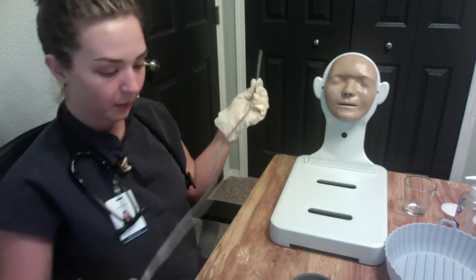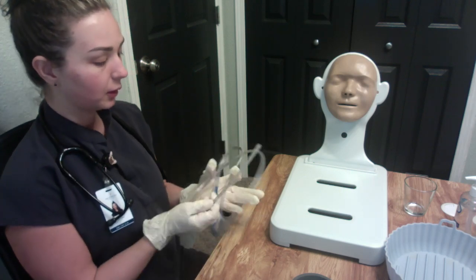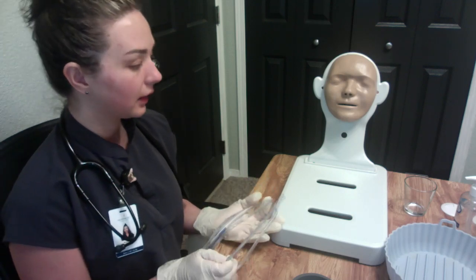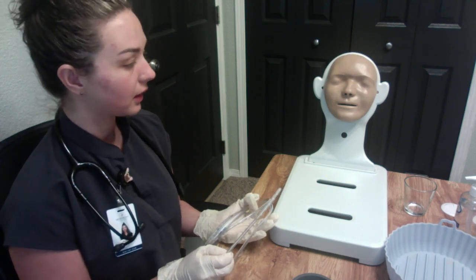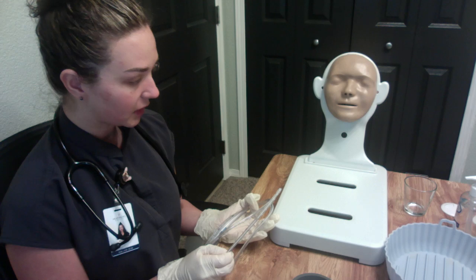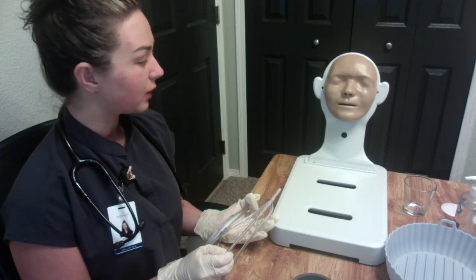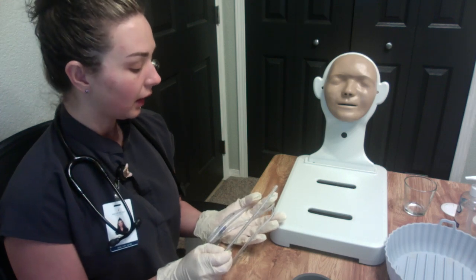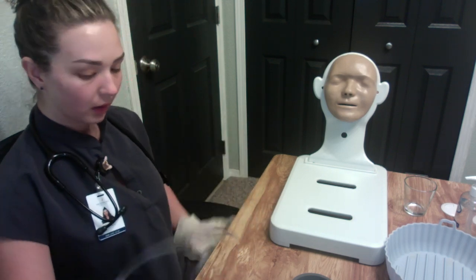Alright, Mrs. Smith, as we do this, I'm going to have you put your head back slightly, and then we're going to insert slowly, 5 to 10 centimeters at a time, as you swallow. We will have you lean forward to help alleviate some of that gagging reflex, and we will also have you take some sips of water as needed. Please let me know if you feel nauseated or uncomfortable. Just raise your hand, okay?